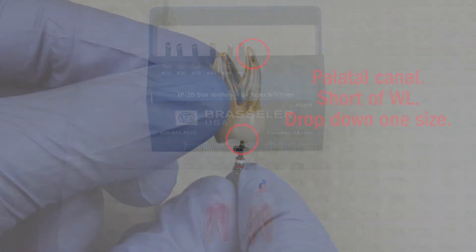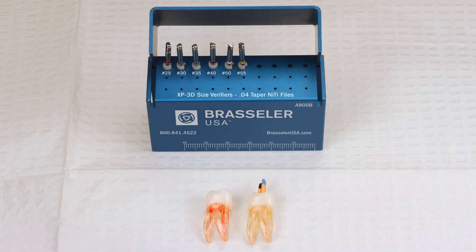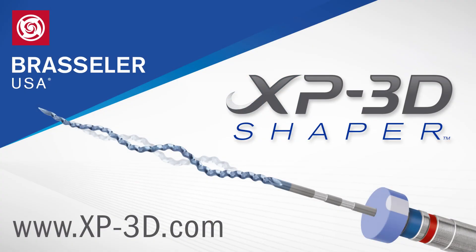Because we are shaping anatomically, many practitioners find that apical gauging manually with NITI files allows them to quickly create a round apical stop, which allows for synchronicity with the master cone and streamlines obturation. Please visit xp-3d.com for more video tutorials on this revolutionary new product. Thank you.